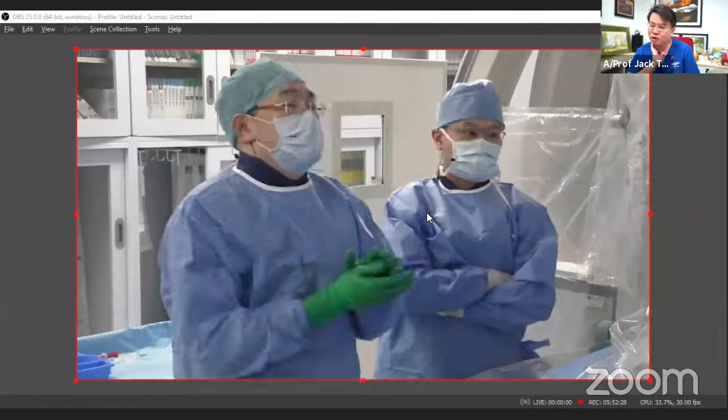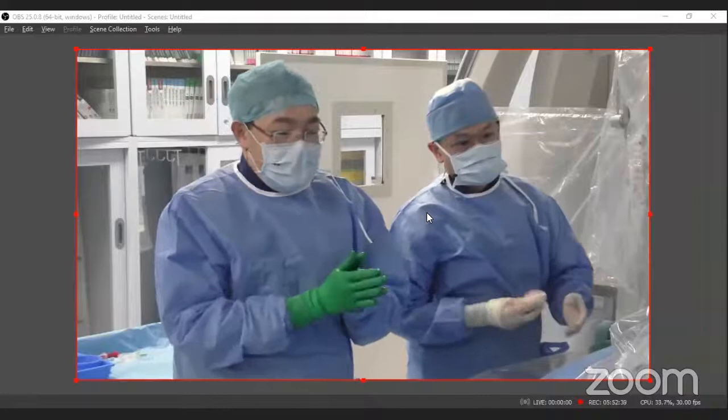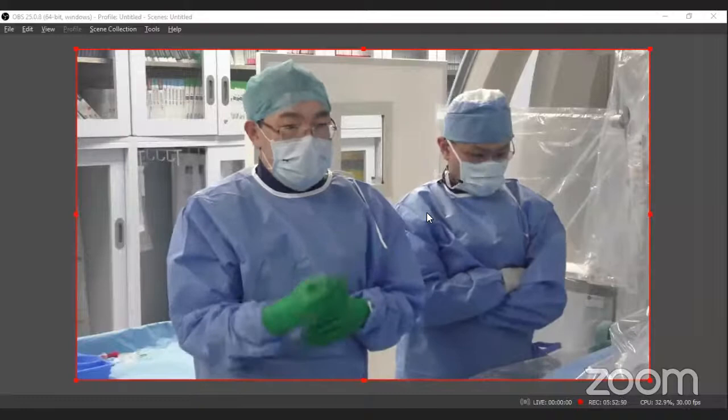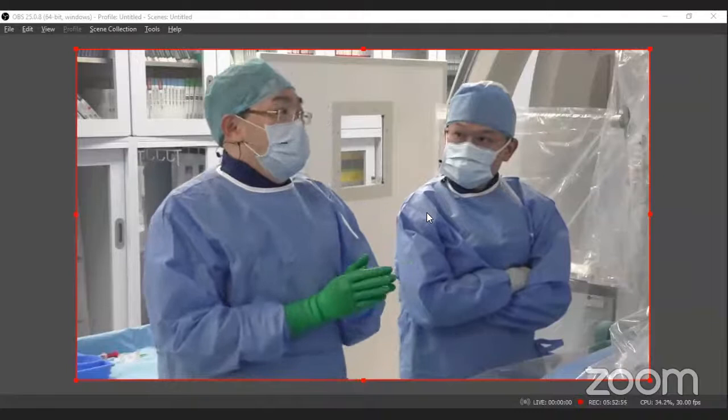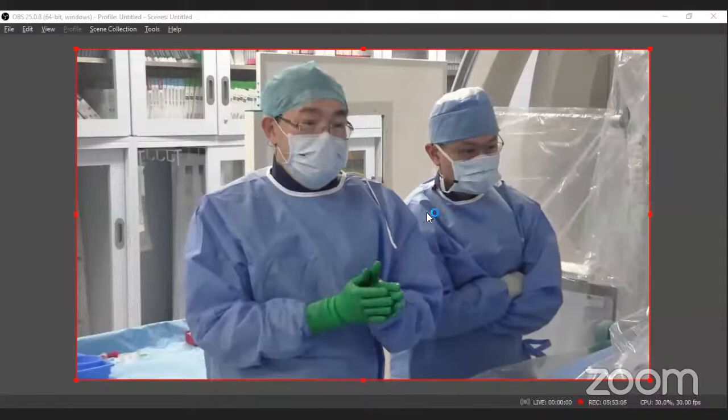Yeah, so I think the main difference between DK crush and Culotte is that if you have two vessels that are very important and you need to keep the wire in, DK crush is actually a more preferred method because it won't lose any branch. So once you stent the branch, you crush it, that branch is patent and you can stent the other one. For Culotte, you may lose one branch, depending on how tight the ostium of the other branch is, because once you stent it, the other branch ostium may get compromised and you may have difficulties wiring that branch, because the ostium is pinched.